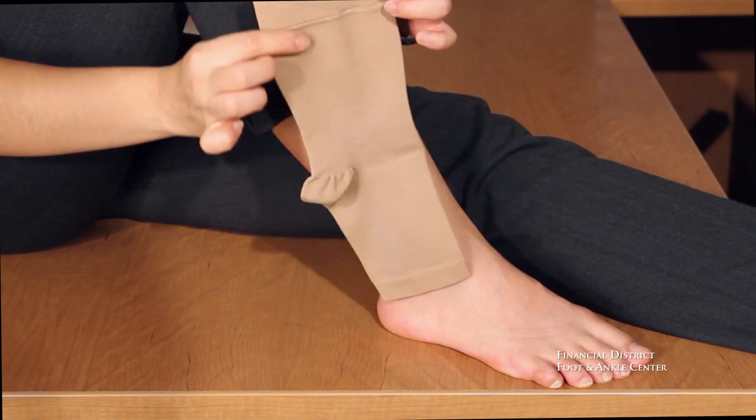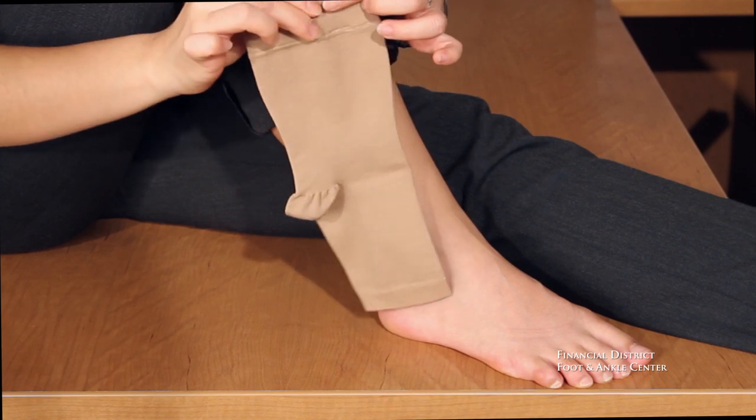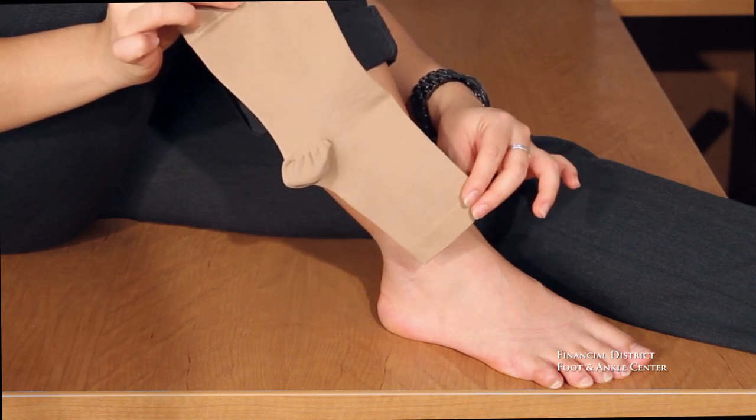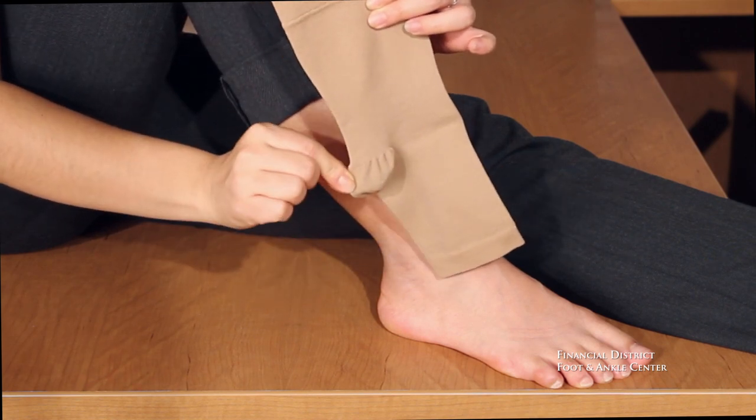You will know which way to pull this on your foot based on the length and orientation of the sleeve. The longer end will cover the area above your ankle towards your calf. The shorter end will cover your forefoot up to your toes.